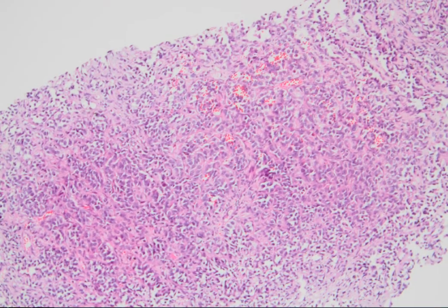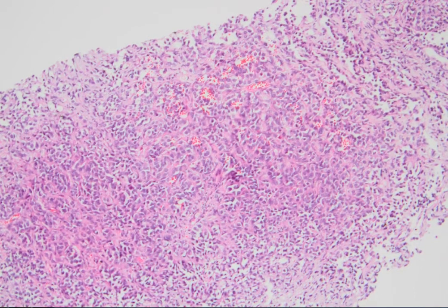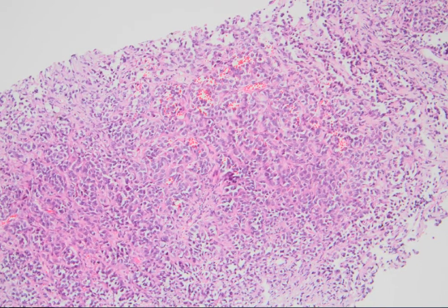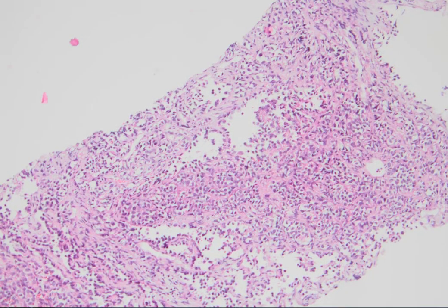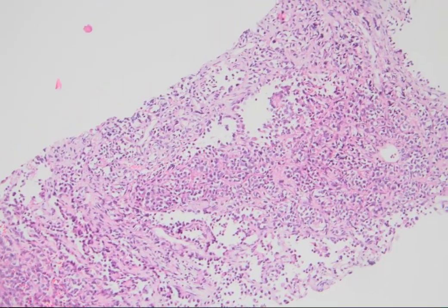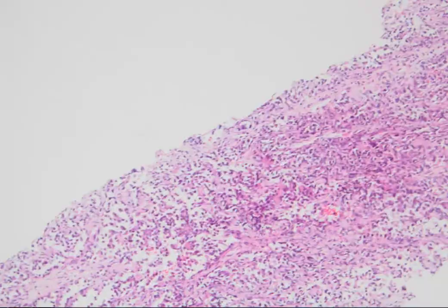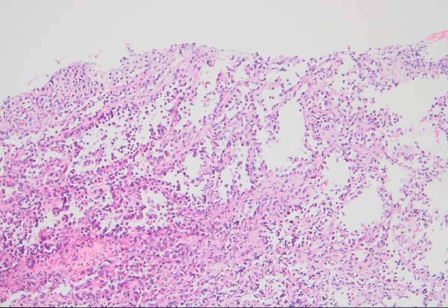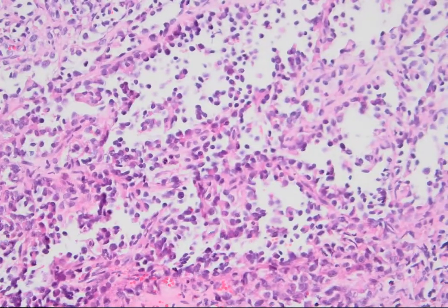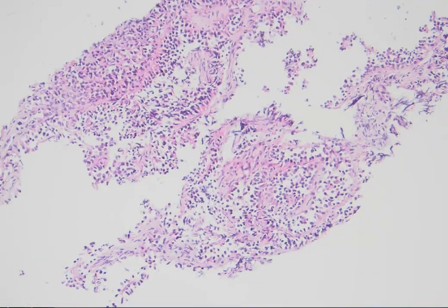Of course, I was blinded by the clinics and synaptophysin positivity, and I just missed the morphology. When we look at the case, what you see are the spaces, right, and the hobnail-like structures. This spacing and hobnail, they are like just covering a space. This morphology should remind us of a vascular tumor.